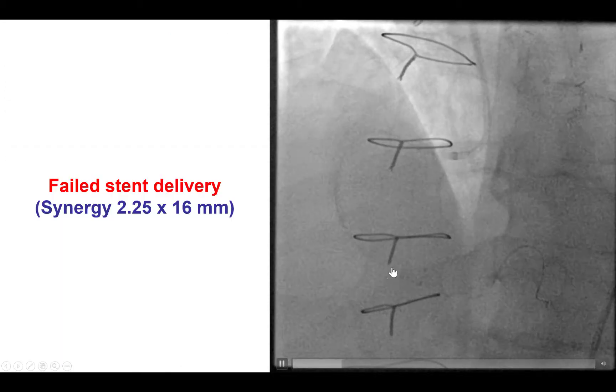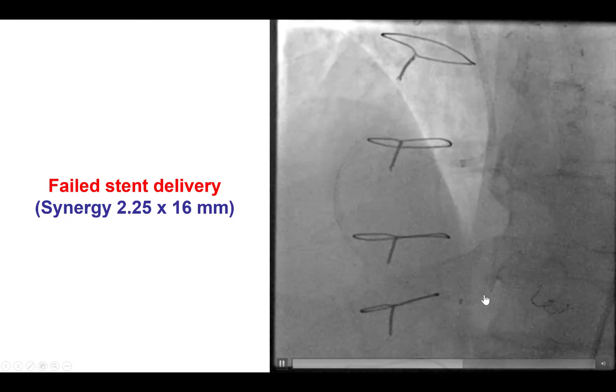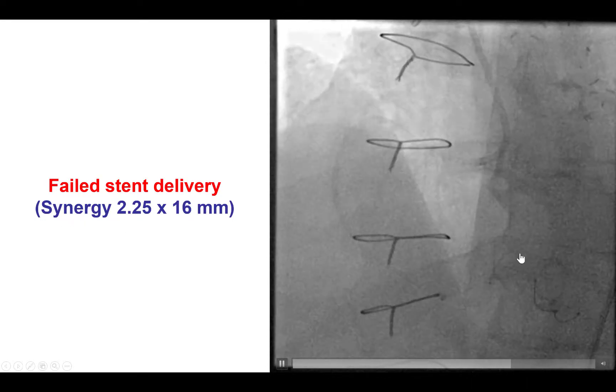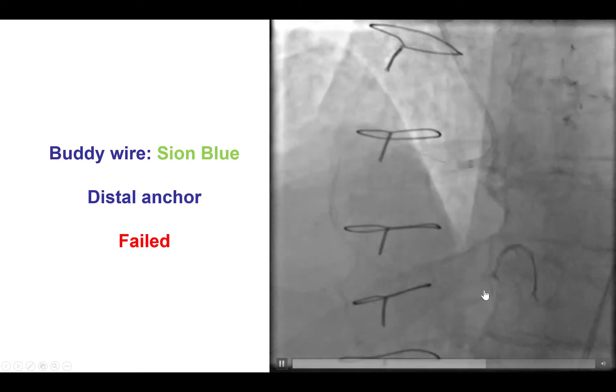However, despite using a very short and very deliverable Synergy stent, we were unable to deliver it to that area of tortuosity. We tried several things, including using a buddy wire — that didn't work. We tried to use a distal anchor by putting a small balloon and then trying to advance the stent over the second wire, but that also failed.